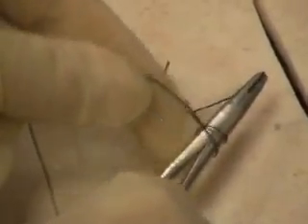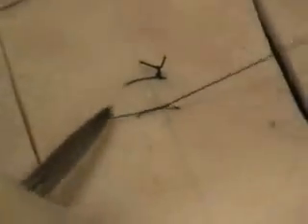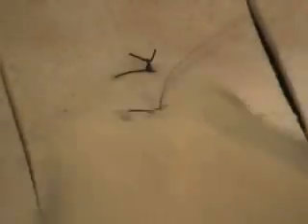So you try to grab as close to the end as possible. And the short one and the long one trade sides. And notice that I'm coming down perpendicular. I'm not coming down this direction. I'm not coming down that direction. They trade completely. That's important.